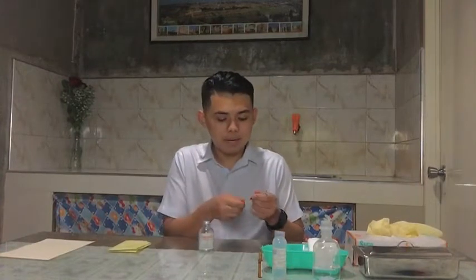Remove the cap from the needle, then draw up into the syringe the amount of air equal to the volume of the medication to be withdrawn, so that we can easily get the intended right amount of medication. Carefully insert the needle into the upright vial through the center of the rubber cap, maintaining the sterility of the needle for us to avoid any contamination.